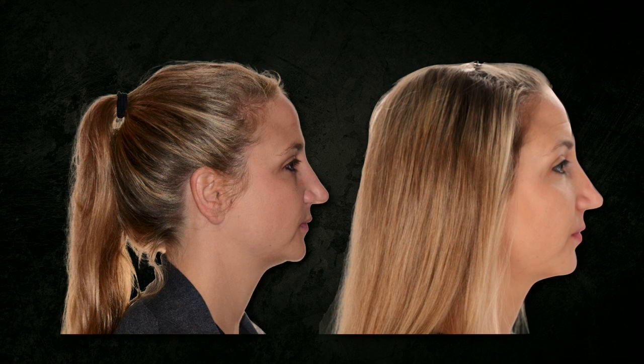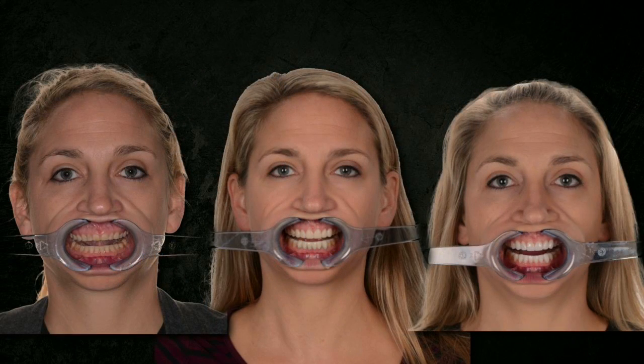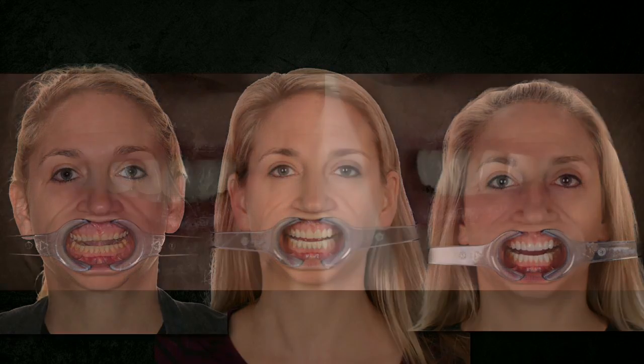And again, look at the better lip support. Spójrzmy na lepsze podparcie warg. Changes we've made to the inclination of the teeth. Jakie zmiany również wykonaliśmy w kącie ustawienia zębów. Showing before, provisional and after. Sytuacja początkowa, sytuacja z pracami tymczasowymi i z odbudowami docelowymi.